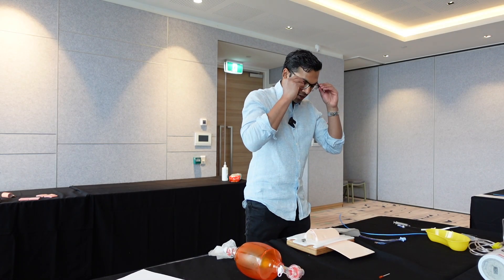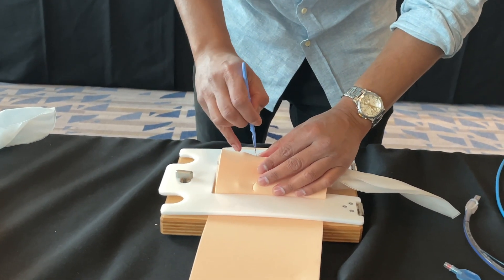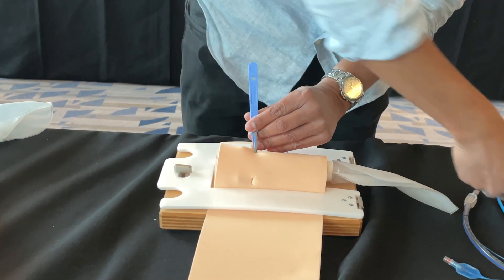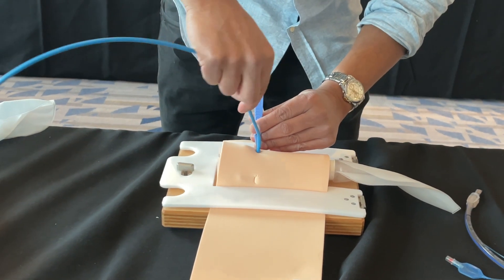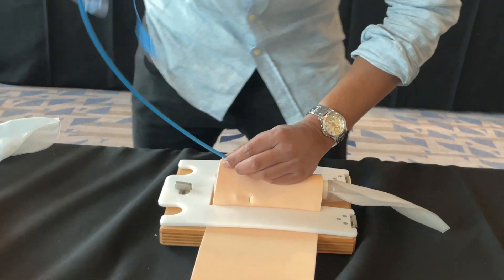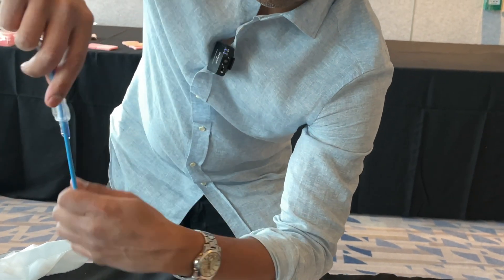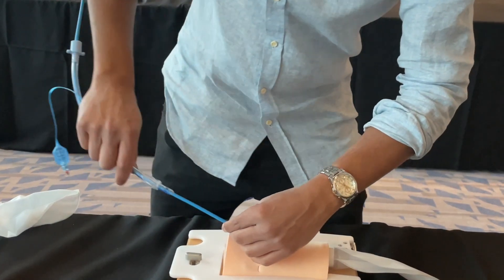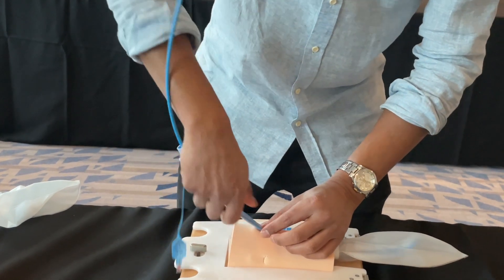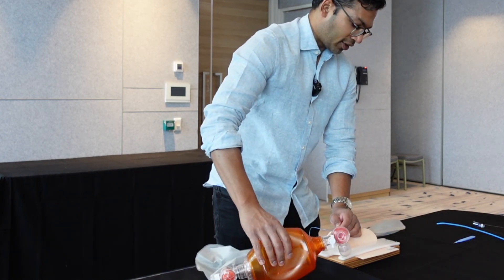I'll now show this in one smooth sequence: laryngeal handshake, making the horizontal incision, opening up the triangle, swapping hands, loading the bougie along the blade into the airway. Then either use the rapid fit connector or connect the tube straight away, railroad the tube, take the bougie out, inflate the cuff, and connect for ventilation.